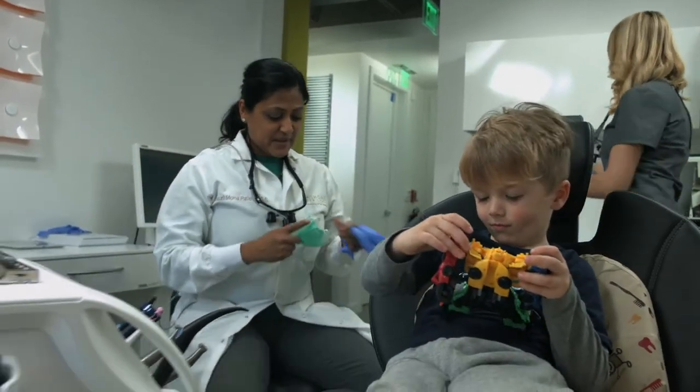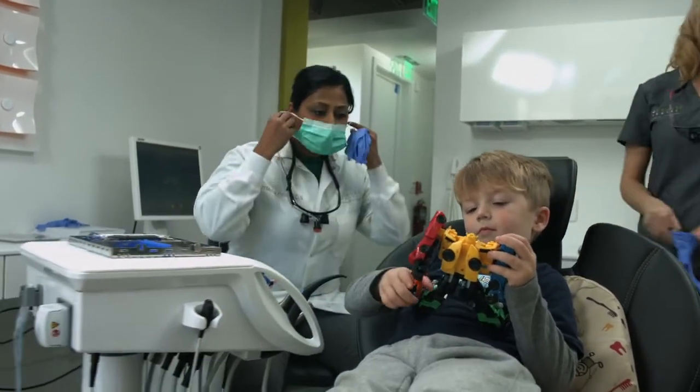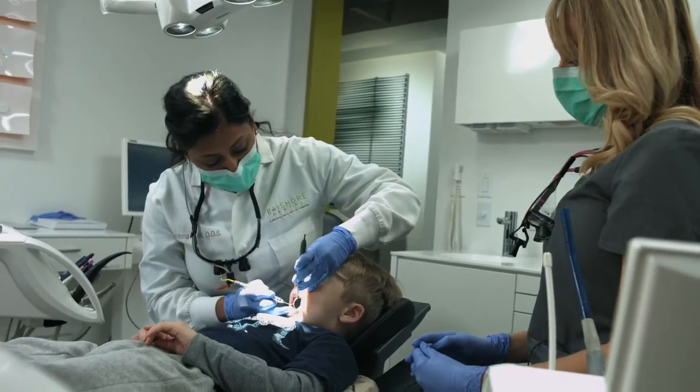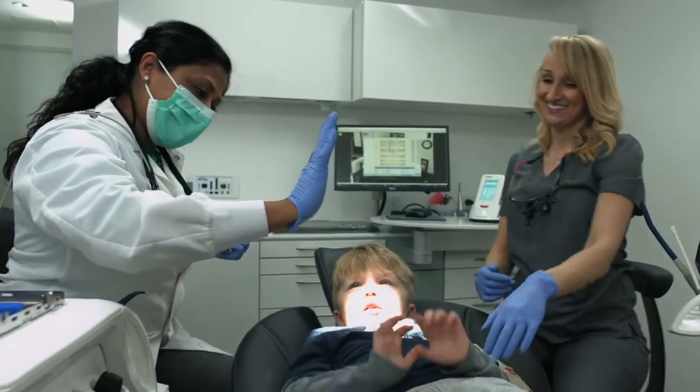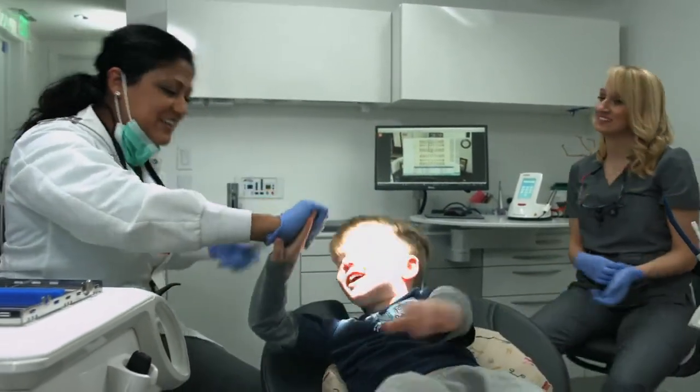And as we all know, seeing is believing, so it's important that they're able to see just as clearly as I'm able to see and understand the need for their treatment. No matter the size of your patients, at Dentsply Sirona we are driven to provide better, safer, and faster dental care to all of your patients.